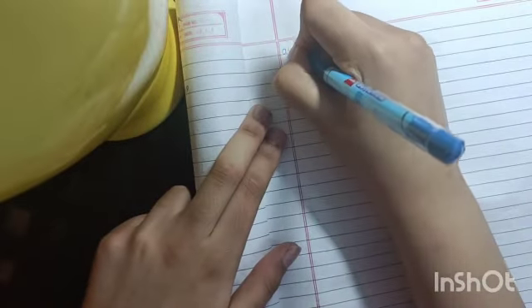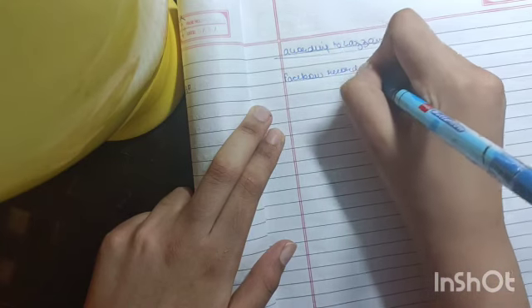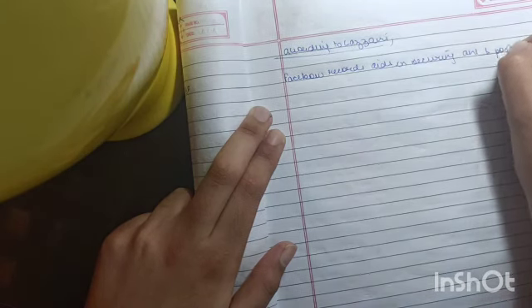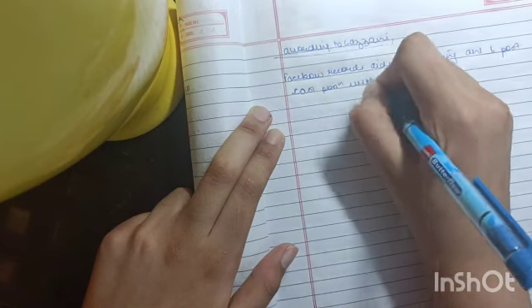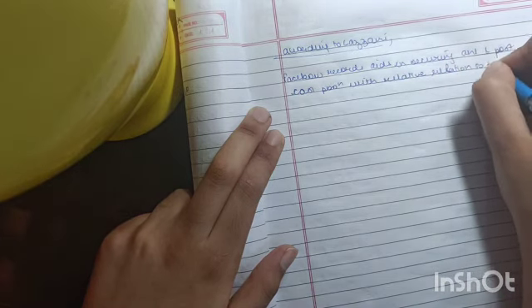Now there is one more thing that you must remember. According to Lazari, he said that the face bow record aids in securing anterior and posterior cast position with relative relation to the condyles of mandible.